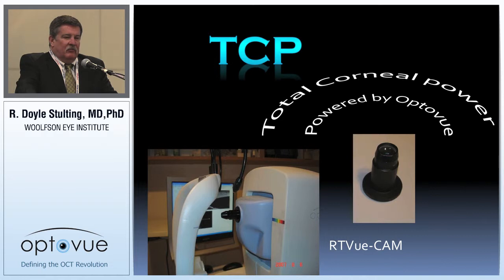Another use that we found for it was the location of corneal flaps in post-refractive eyes, ones that were referred to us where we didn't know the exact flap thickness. We were able to identify the flap interface in many of these with a resolution that was unavailable in other devices. So that was my introduction to it.